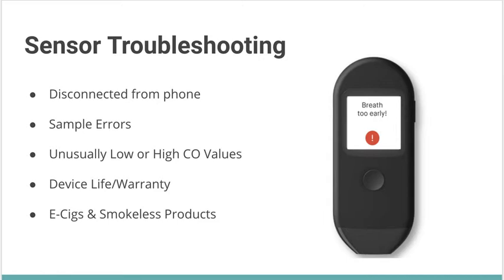Now for extremely high values, like above 100, it could be that they took a sample immediately after they smoked and they need to wait 5 minutes, or their device could be malfunctioning. In this case, they would need to send that our way.